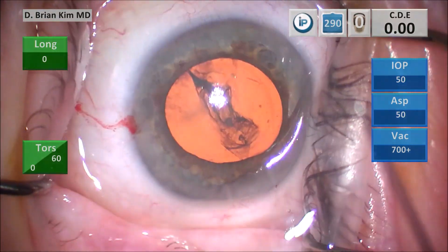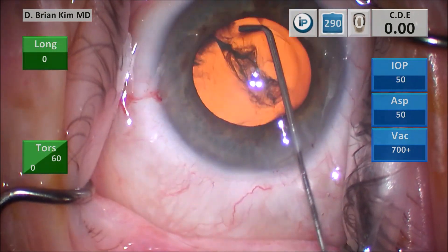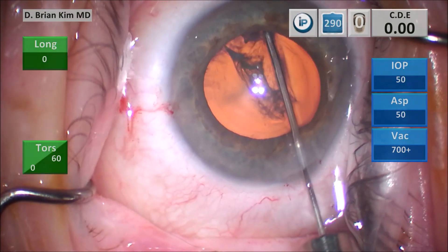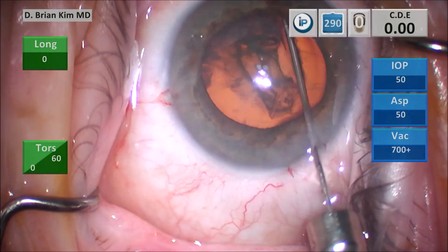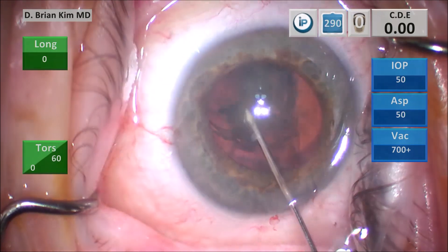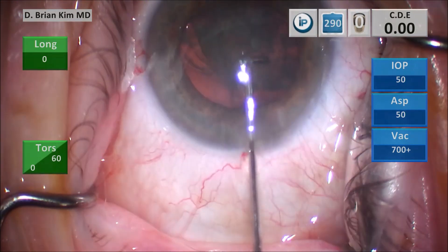I start the capsular fornix hydrodissection technique. I place the cannula underneath the rexus edge to the contralateral equator, get a nice fluid wave, turning the tip down, then turn the tip back up, decompress on the left side, take the tip to the right side pointing downward, and you get a nice rotation of the lens.